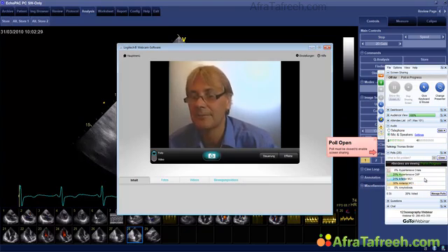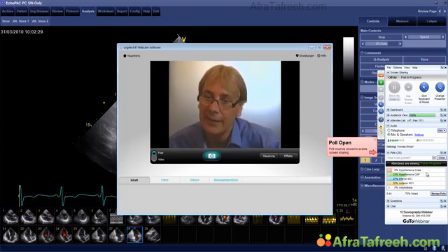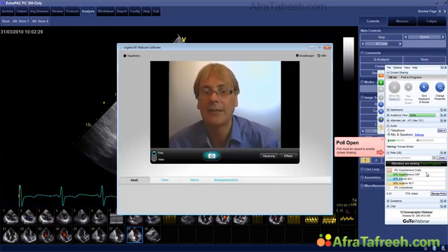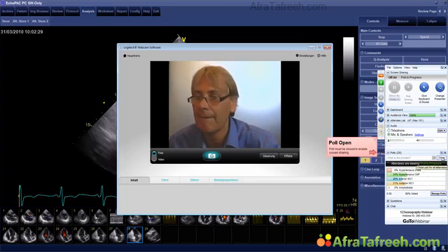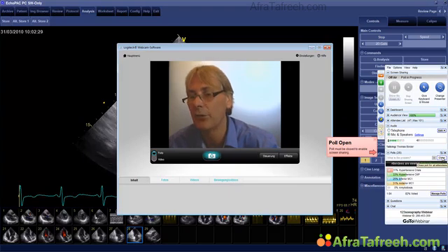So even if you don't know what it is, at least make an educated guess, because that does, at least put you in the driving seat. And I will then show you, of course, the correct answer. Okay, still a few more to go. Okay, I'll close the poll now.